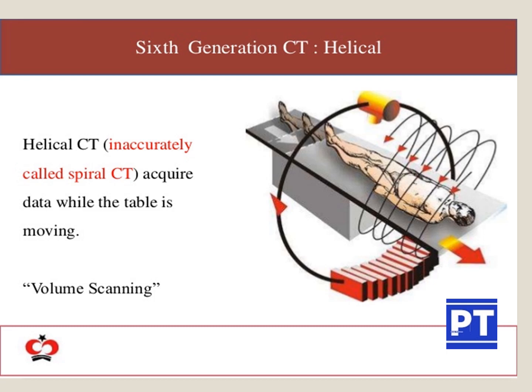While in the case of a helical CT or the spiral CT, we are getting volume data, a volume of slices we are acquiring on the monitor. So the scan time will be completely reduced to seconds. Within seconds, the scan will be finished.